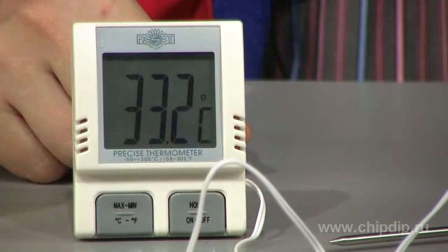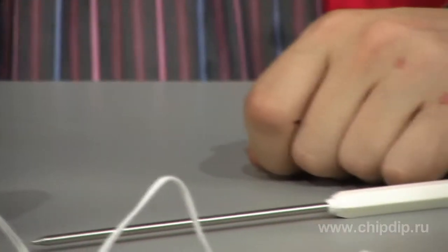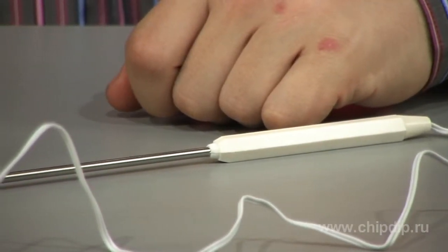Let us consider a digital multifunction thermometer 07761. This device, with a large contrast display and long remote test probe of 125 mm, is designed to identify and monitor temperature. The temperature measurement range is from minus 50 to 300 degrees Celsius, and the device does not need calibration.